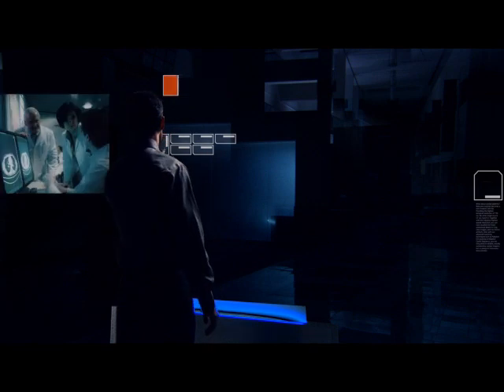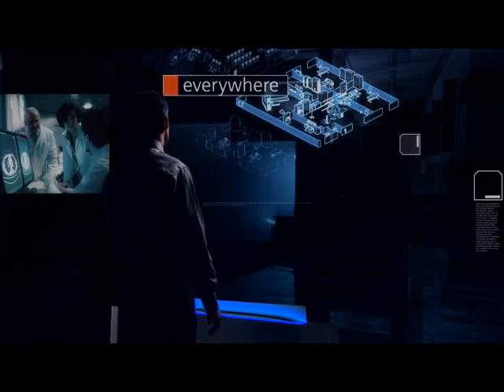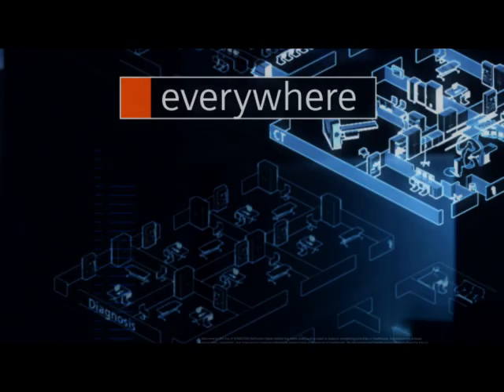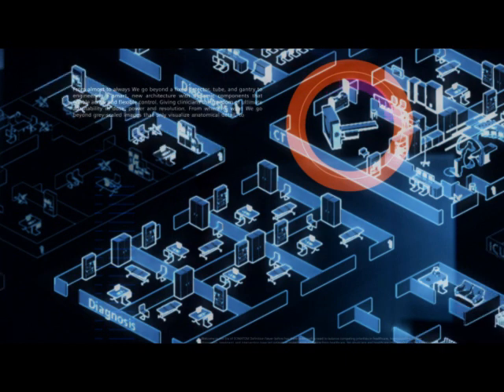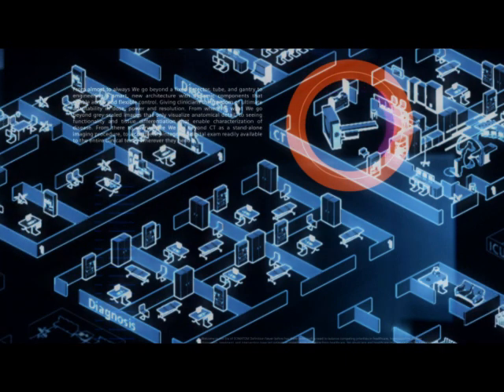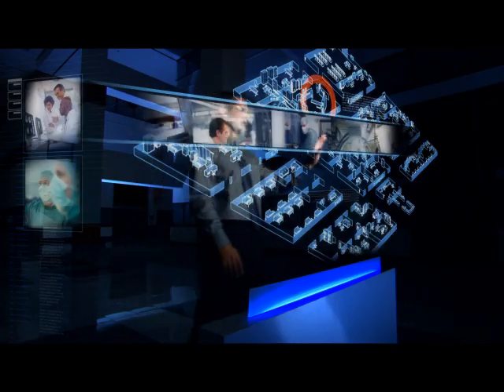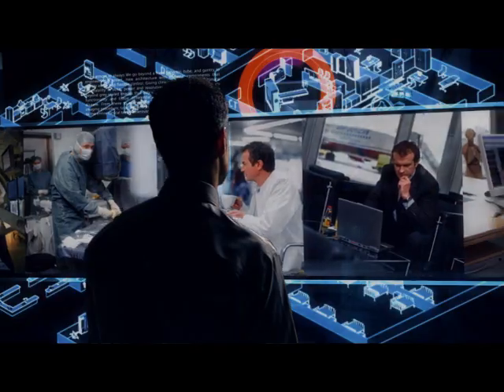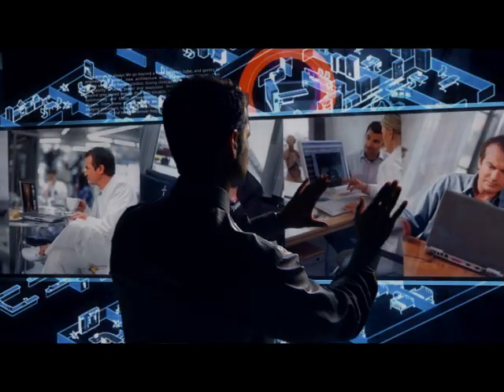And finally, we move from there to everywhere — going beyond CT as a standalone imaging procedure, to a completely integrated digital exam, readily available to the entire clinical team, wherever they need it.